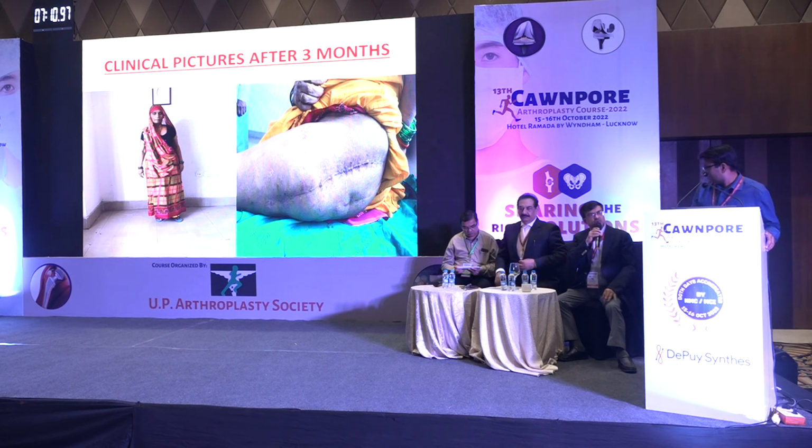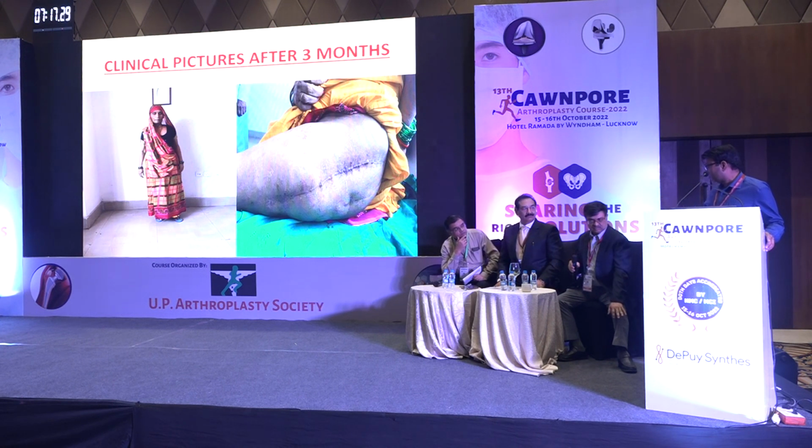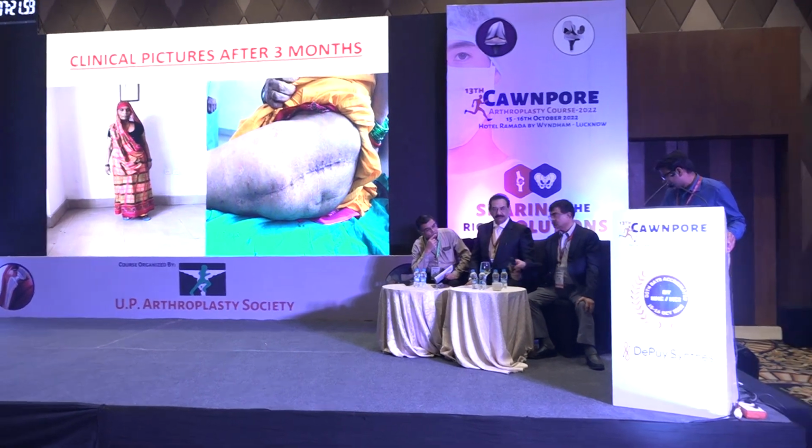I'm quite comfortable. Why did you not use a cementless stem in this? Sir, it was a type C canal, osteoporotic, and I was not comfortable with a cementless stem in this case.